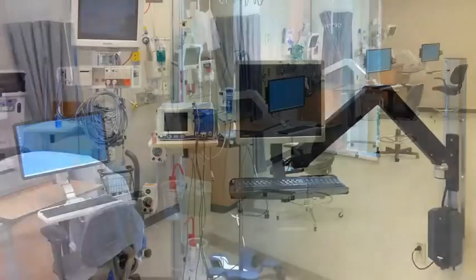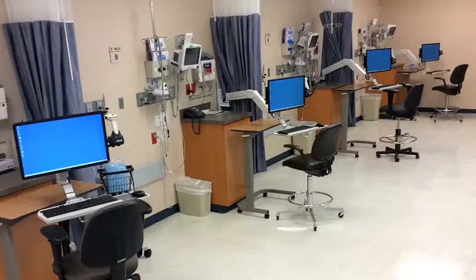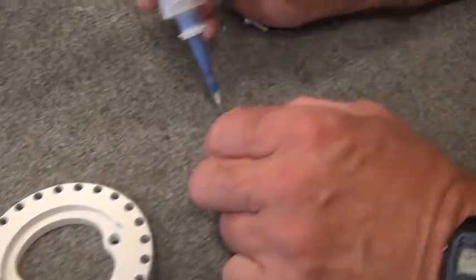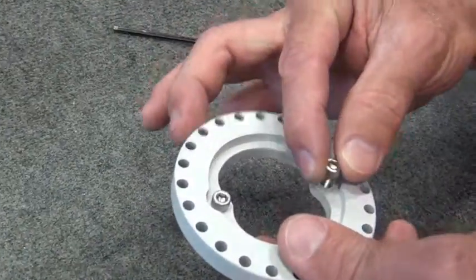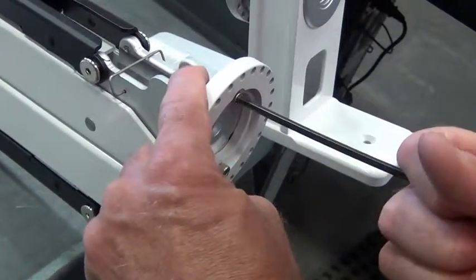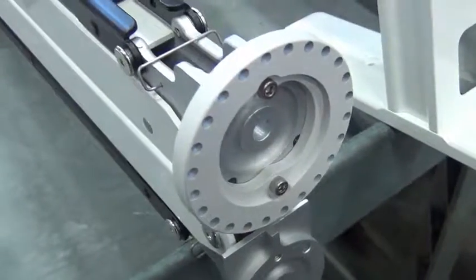All ICW products are assembled by hand for each customer's order. This video shows assembly of the ICW Elite arm. The adjustable rotation stop limits the arm's horizontal rotation. Blue Loctite is applied to the 10-24 by ½ socket head cap stainless steel screws.